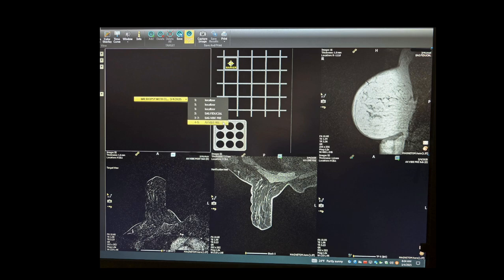And when you get those post-contrast images, they will be sent to Dynacad, which is a program that will help you target the right area on your MR-guided biopsy. So this is what you see on Dynacad. The first thing that you have to do on Dynacad is to mark down where your fiducial is in the grid.